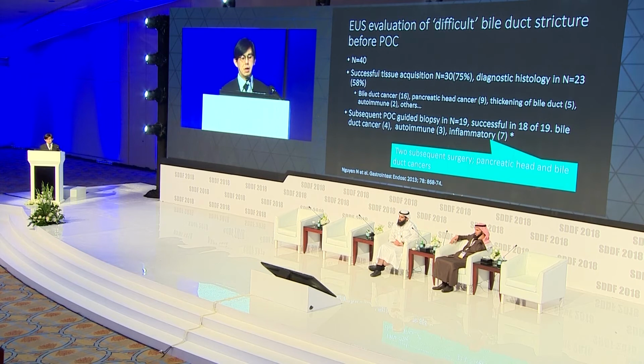Should we use the SpyScope all the time? The answer is probably not. There's no universally agreed definition of indeterminate bile duct stricture, but most people would accept a bile duct stricture without a mass in cross-sectional images as a definition of indeterminate bile duct stricture.